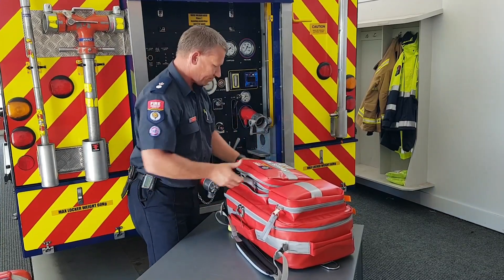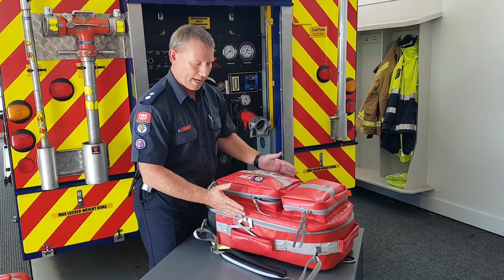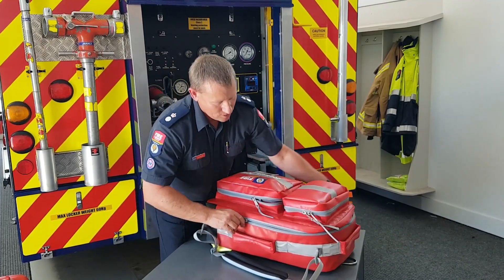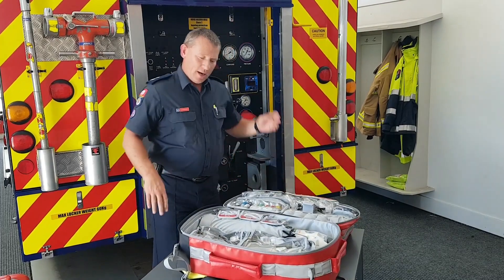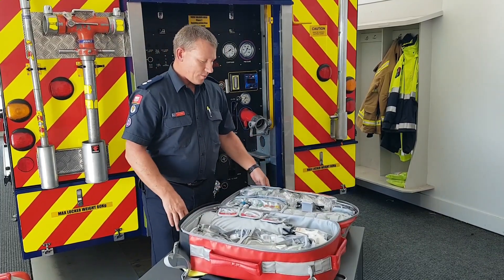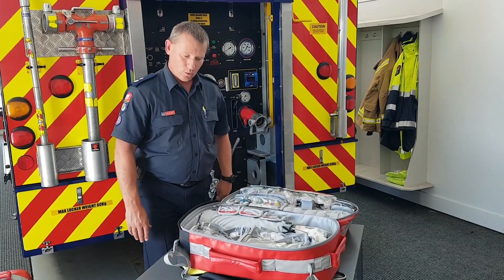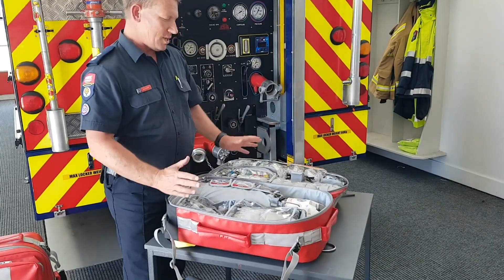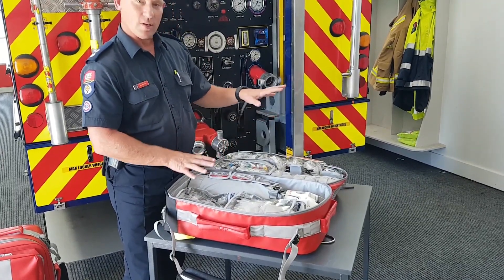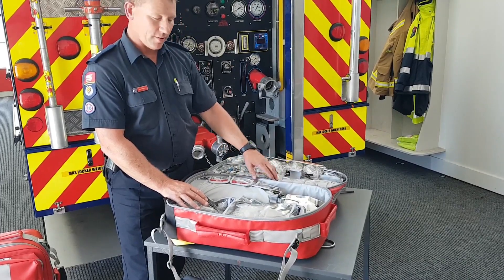In the main body of the pack is the resuscitation material. The pack has been changed so that when it's placed at a patient's head everything can be easily reached — the old packs used to fall longways and you couldn't actually reach all the equipment from working around the patient. Everything here is clearly labeled: red writing is adult, blue writing is child. On the oxygen cylinder there's a duplicate set of oxygen masks and nasal prongs for adults, which is the most common use. Everything to do with a resuscitation is available straight on the opening of the bag. You've got your gloves here, protective glasses for the person working near the airway — all ready to go.